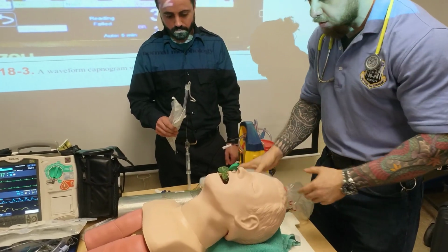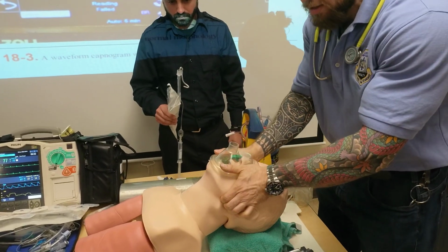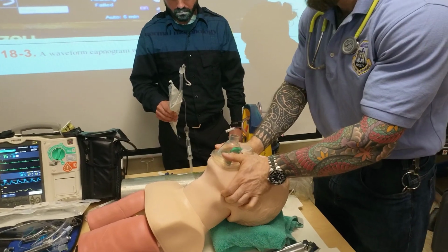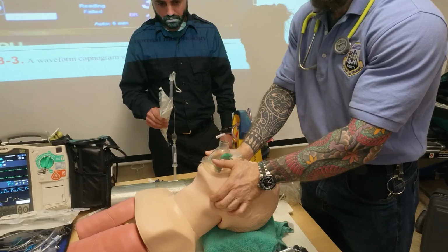Pulse ox is on. So we pre-oxygenate this guy, and then I'm looking at the monitor. It's been 2 minutes. Pulse ox is 100, and I'm ready to go. If I had to push the drugs before this procedure, I already did it. I have IV access in place in case the patient decompensates.